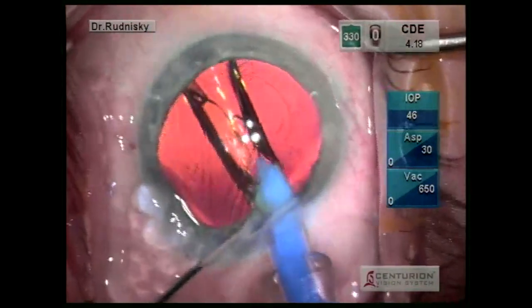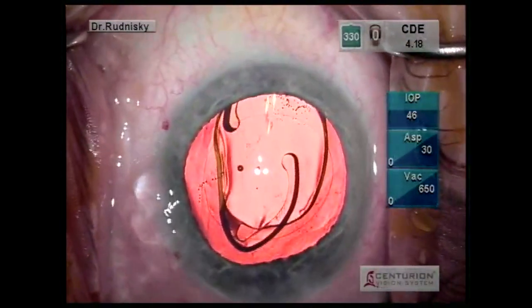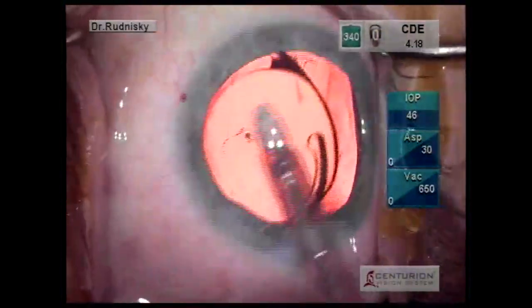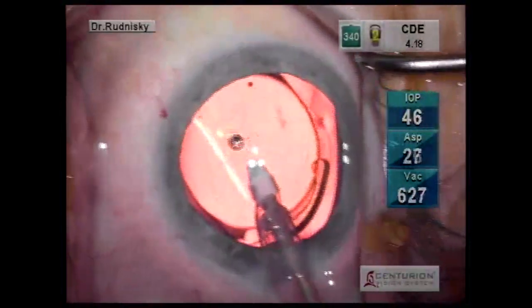Now the key here is you twist the complex clockwise, basically trying to push the optic away from the haptic, and here you can see in this case it releases without any pressure at all. To be honest, that doesn't happen on every single case, but I certainly get far fewer stuck haptics using this technique.